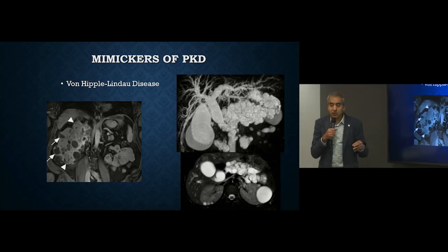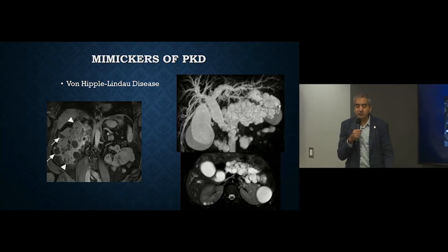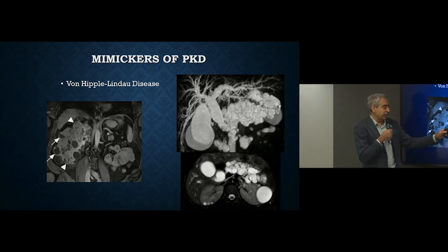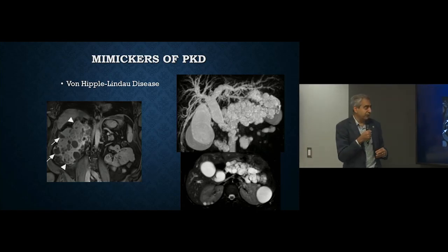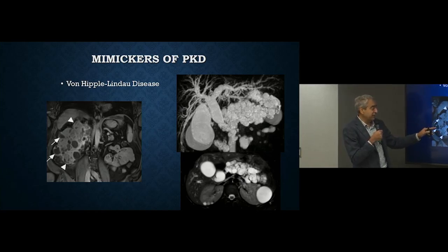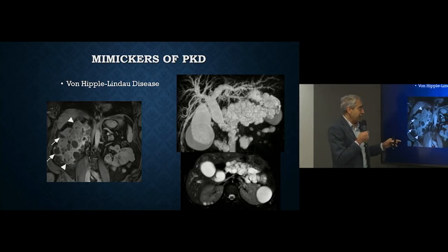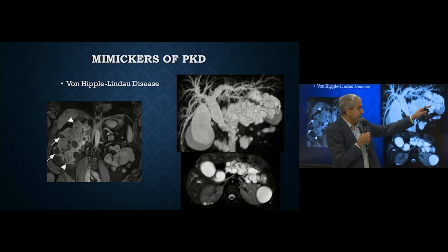I would say probably once every other year we make a de novo diagnosis of von Hippel-Lindau on imaging, depending on which organ it's involving, but usually it's based on the renal manifestations. We see a patient with multiple renal cell carcinomas, solid renal masses, but sometimes we can see cysts within the kidneys, and we can see other cystic tumors elsewhere.